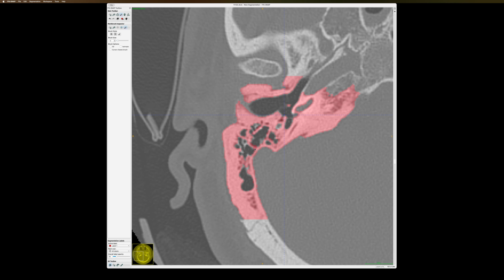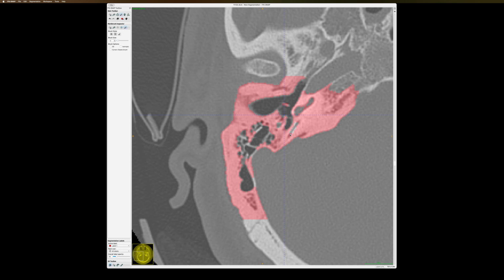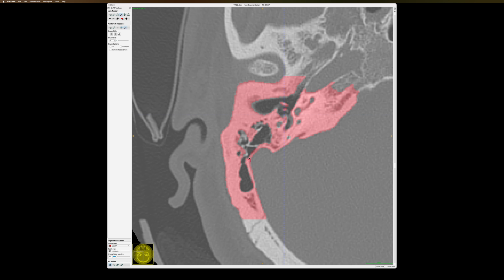Eventually at that level, I noticed that these are the semicircular canals. I lied earlier, I didn't fix them when I fixed the facial nerve. And since they were obliterated, I just opened them up, them and the cochlea.